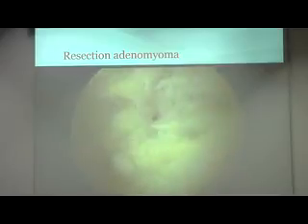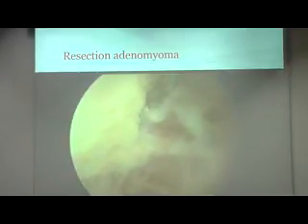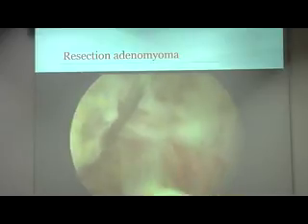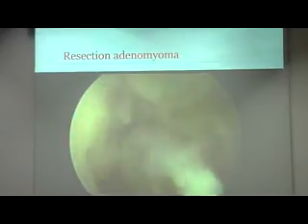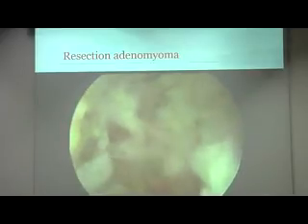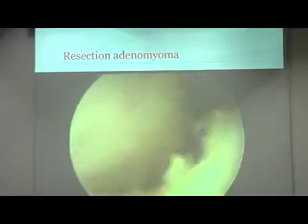Here you see this tissue. And if we go to the tissue removal, you see the vessels. Again, this neovascularization, pseudocapsula, all with vessels. So here you really need to know what you do. Because if you cut like Harry Cowboy, then you become barbecue Harry. You coagulate everything and it's ruined. You really have to be very careful.